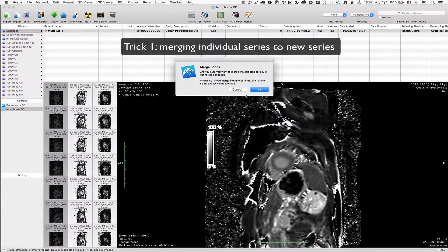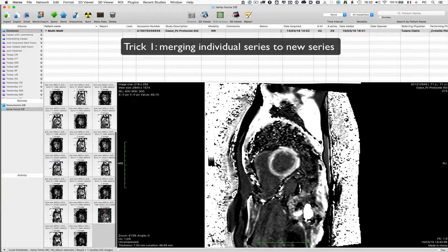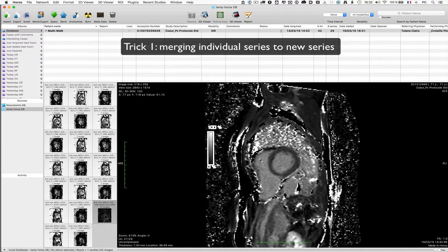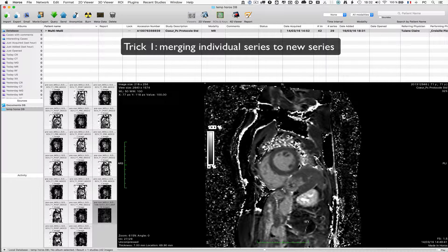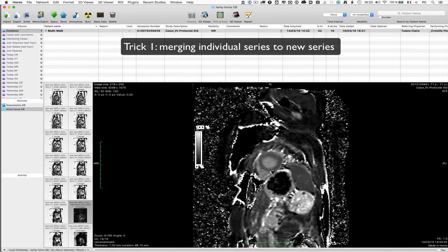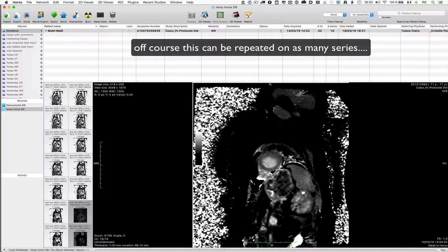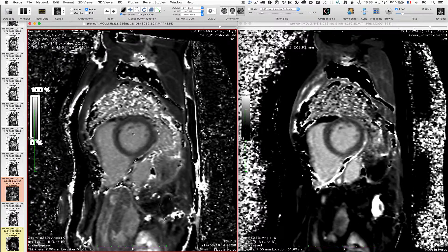That will produce a new series containing the 14 images of ECV maps. I'm going to repeat the process for the native T1. And now I have two series with ECV and pre-injection T1 maps.